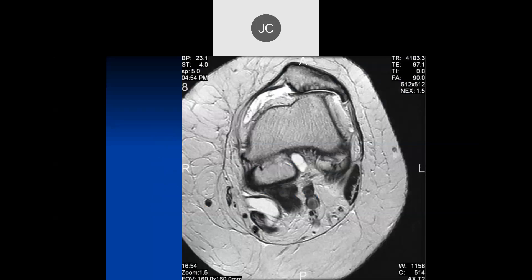So on this axial T2 of the knee, we're seeing lateral subluxation of the patella — maybe a little bit, we'd have to see more. There's a lot of degenerative disease of the patellofemoral joint, grade 4 chondromalacia, large osteophytes, and so forth.